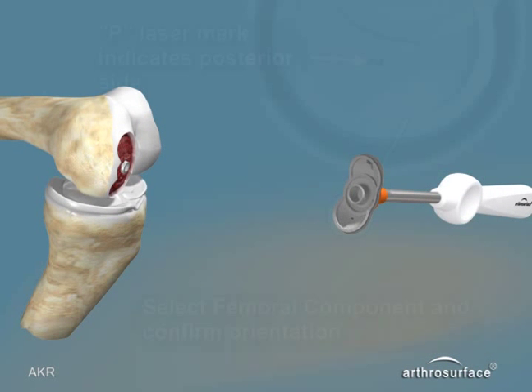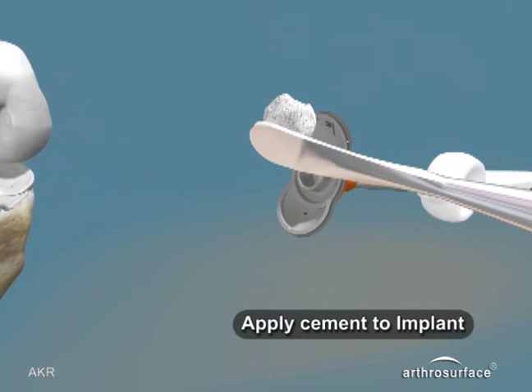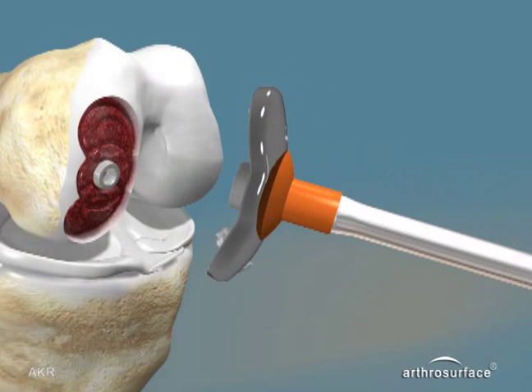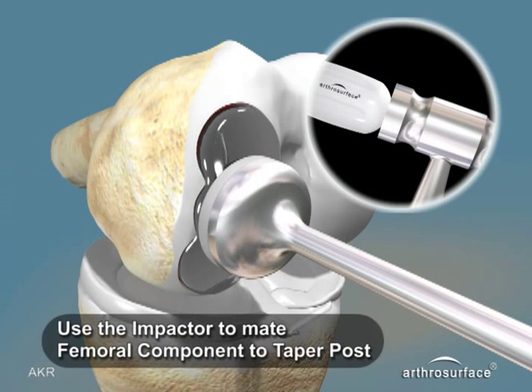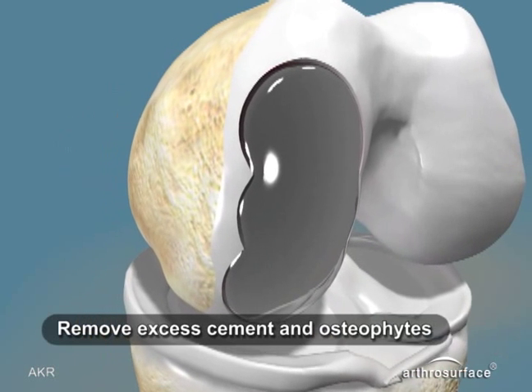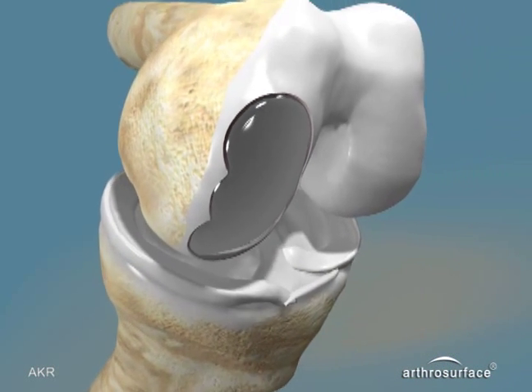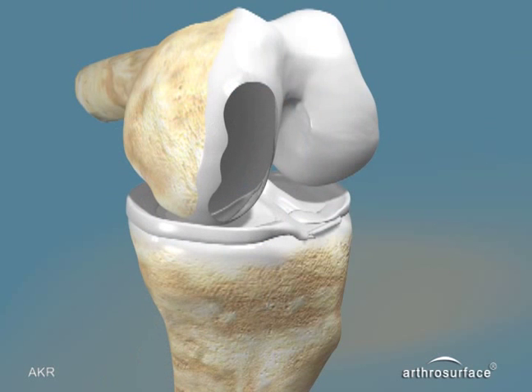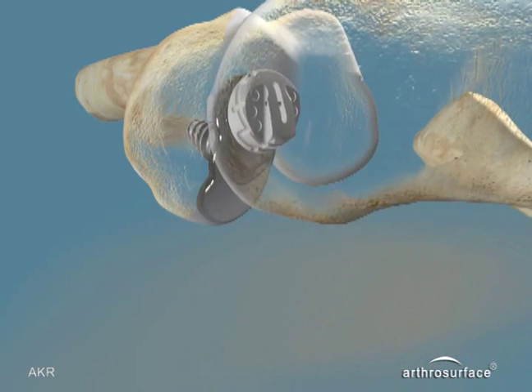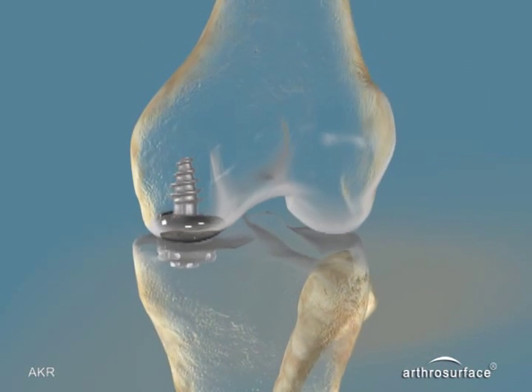Open the articular component for the femoral side. Confirm the orientation is correct with the P laser mark indicating posterior, and apply appropriately sized amounts of cement to the underside of the implant. Use the impactor and mallet to seat the final implant, and remove any excess cement and all osteophytes. The Arthrosurface Unicap procedure is now complete.